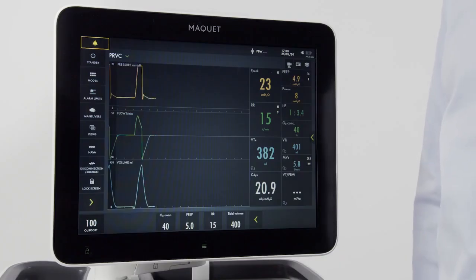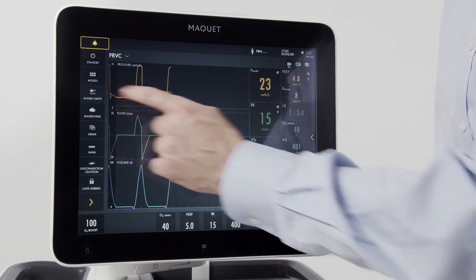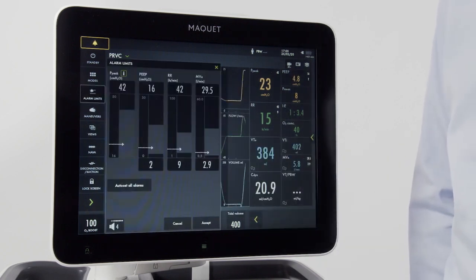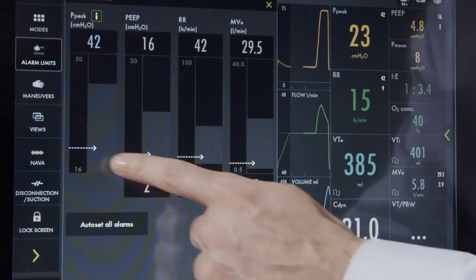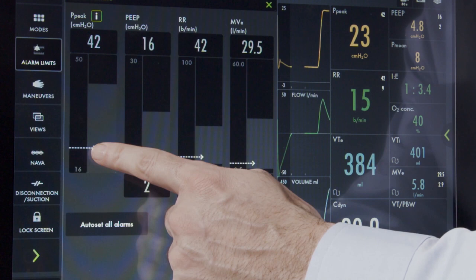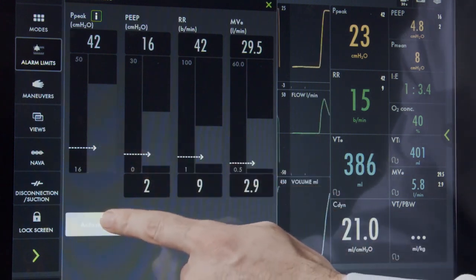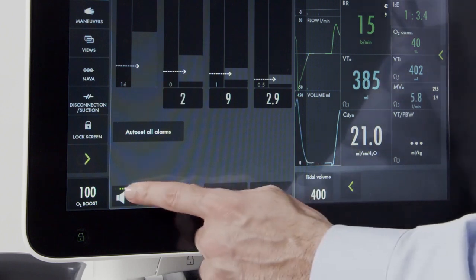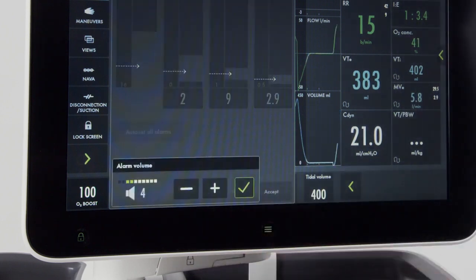To access the alarm settings, press the alarm limits button. From here, high and low alarms can be set for each parameter. The white arrow indicates the measured value for each parameter. You also have the ability for auto-set of alarms — when pressed, the machine will recommend settings for each parameter. Alarm volume may also be adjusted if necessary.